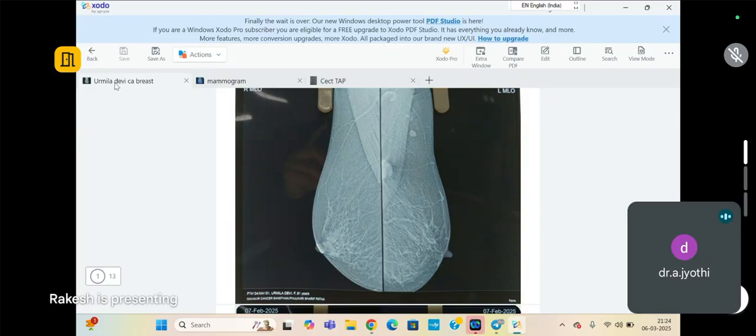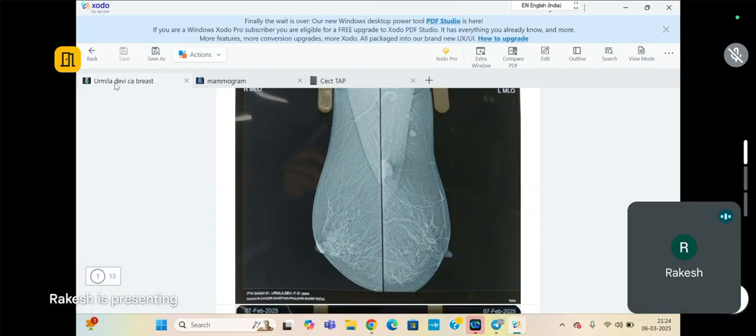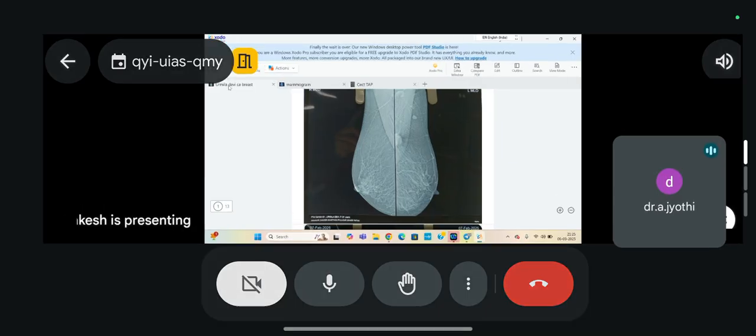And the most important thing you didn't tell. Microcalcification. Microcalcifications, vascularity. No, that you don't see in ultrasound. Axillary lymph nodes. Nodes, yes, ma'am. Nodes, correct? Yeah. And something else. Something characterizes the lesion, no? So based on that only you will take a decision on what to do. BI-RADS. BI-RADS staging, yes. Very important, no? Yes, ma'am. Now you tell me what is BI-RADS?